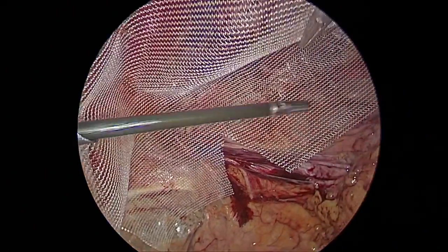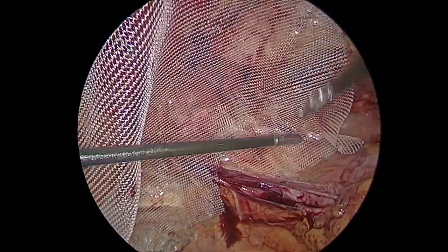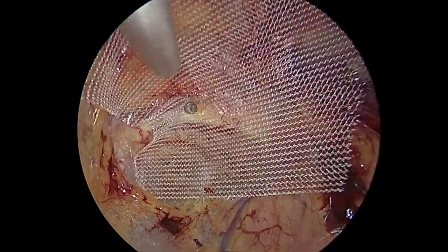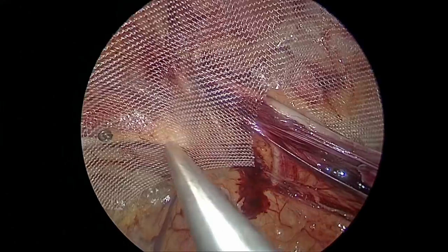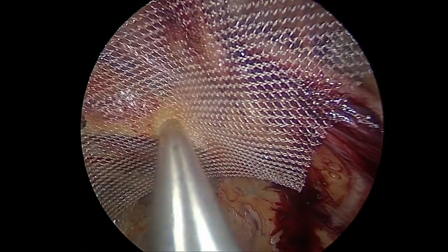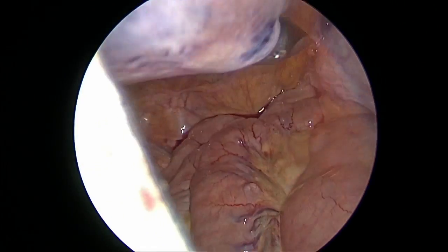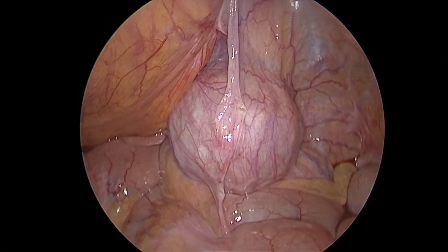However, the steep descent into the pelvis was causing the mesh to lift up on the lateral aspect. So what we did was we made a small cut in this area, and that allowed the mesh to take the contour of the pelvis. I then fixed the mesh inferiorly at 2 spots. So we have covered the inguinal defects as well as the Spigelian hernia.